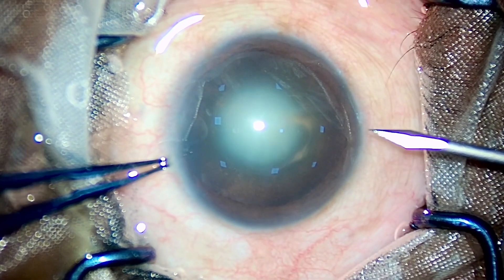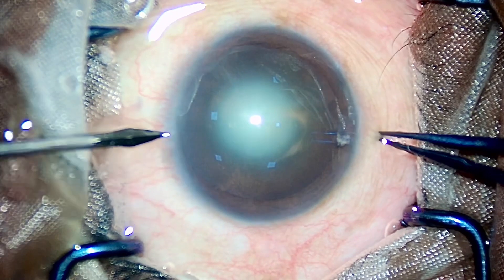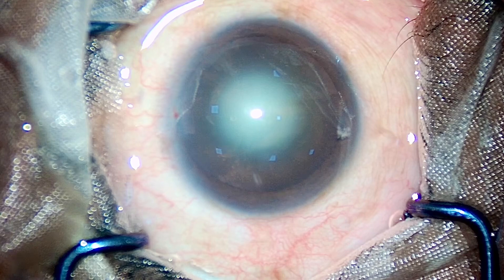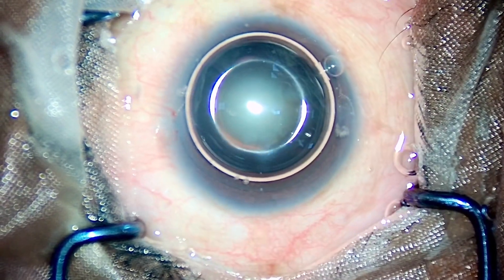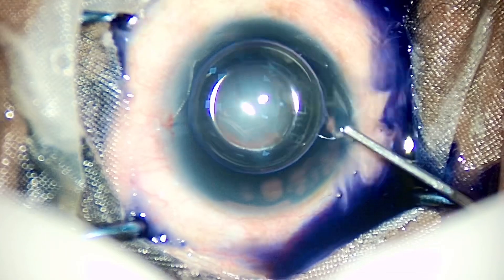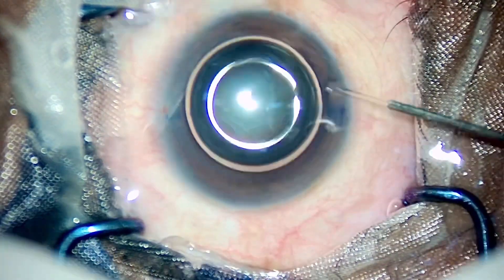Hi there, dear friends, colleagues, and junior residents. Today is a very interesting case that I am going to present on my YouTube channel. As you must have read in the thumbnail, I want you to figure out when I caused a posterior capsular rupture in this case that I am operating. It's kind of a quiz video for all those residents who are good at observing things, and it will require attention to detail.